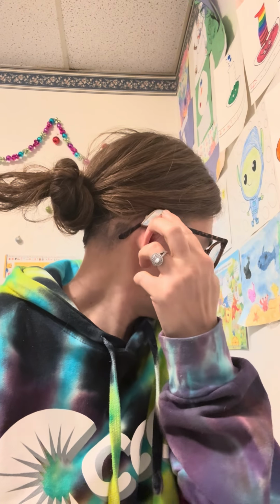Put the ear mold in first. The part that goes in your ear canal goes in first. Then the top of the ear. And then you wrap this around the back. And then you look in the mirror and you see where there's a gap.